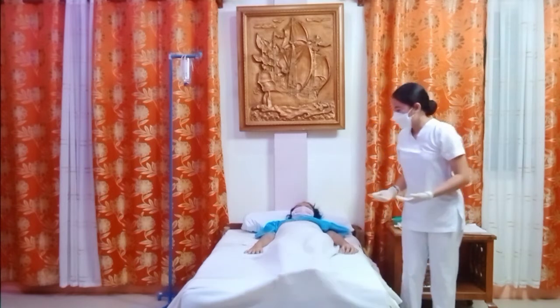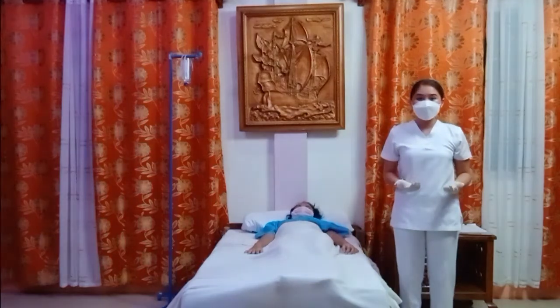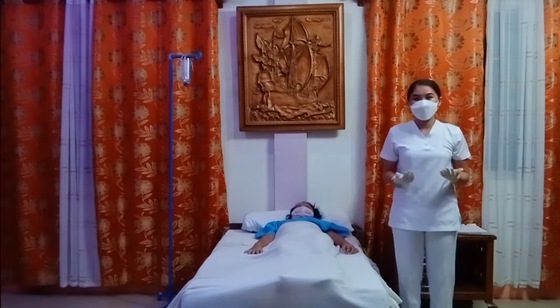Correct positioning will promote good body mechanics and will ensure that the client is in a comfortable state. It will also enable the nurse to attain accurate temperature reading.